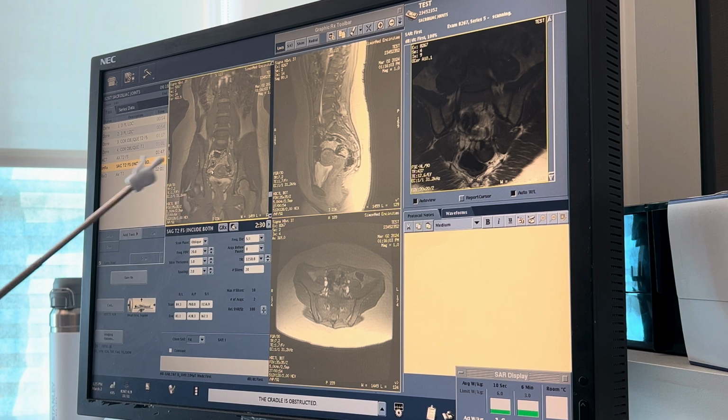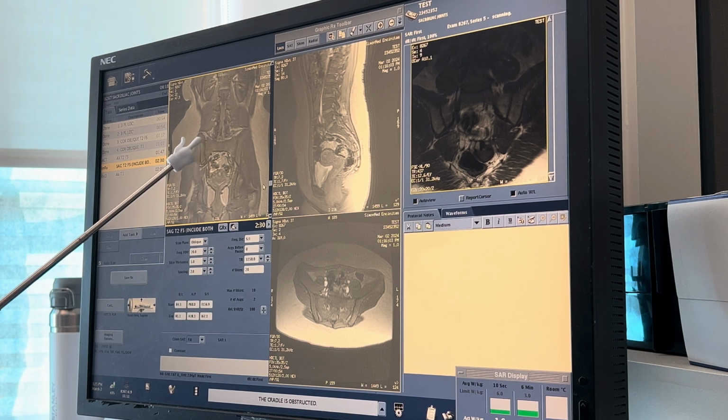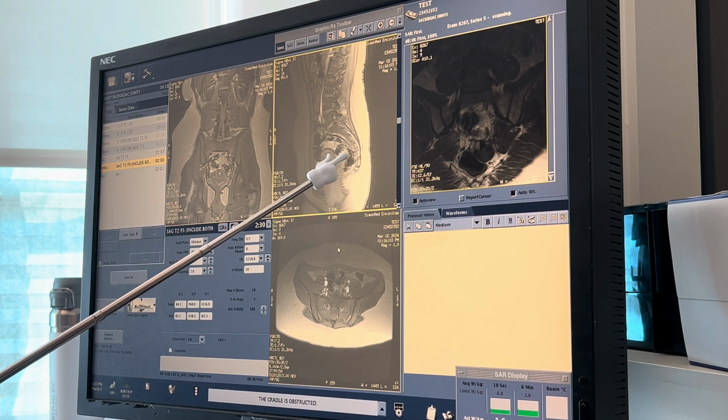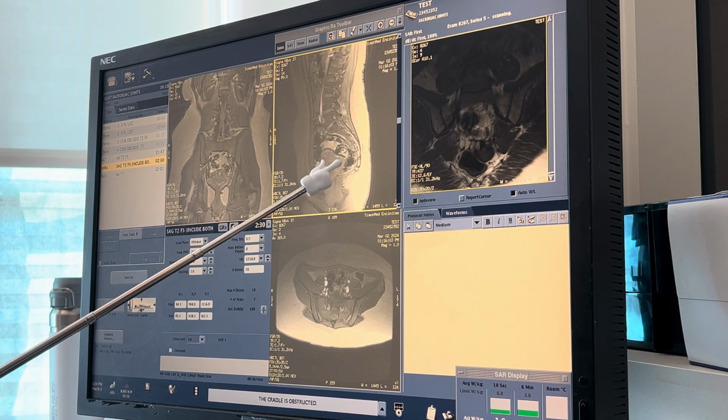So let's find it here. So I think you're gonna have to go back. There's sacrum. There you go. So we're doing our SI joint. Okay, so we have our money slice over here too. So I want you to drop your FOV like right here, right within that curvature of the sacrum and coccyx. Perfect.